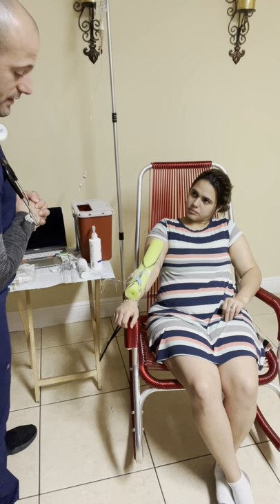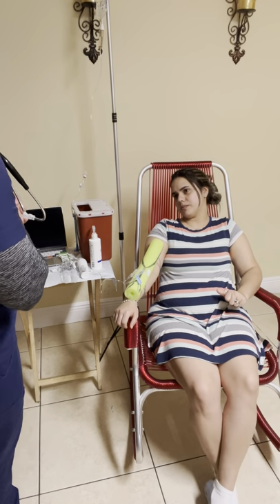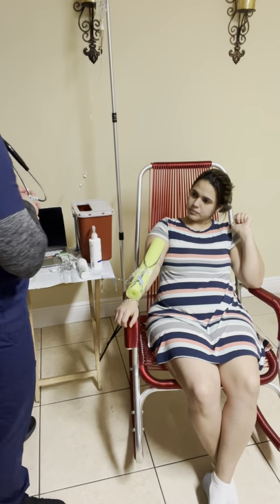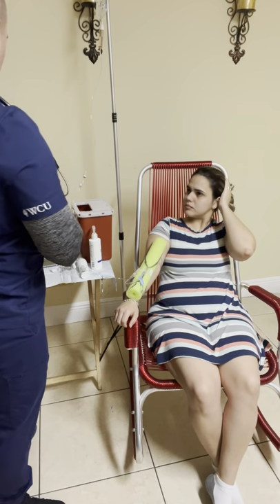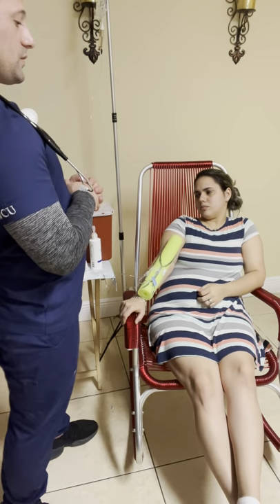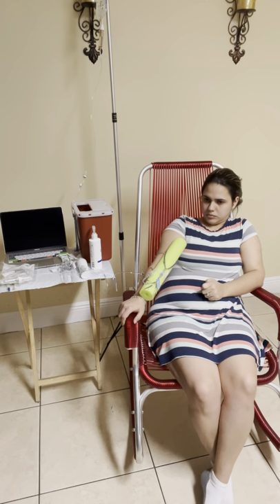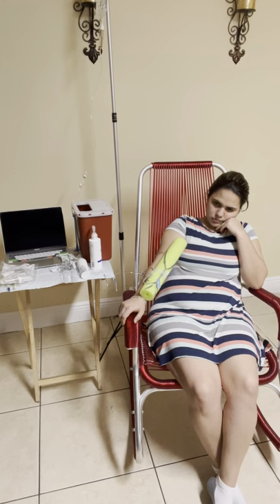Before I give you the medication, I have to ask you some questions, okay? May I have your name and date of birth? Rosalia Benedict, 1 de noviembre de 1991. Okay, perfect. Do you have any medication allergy? No. Any latex allergy? No. I have to ensure the patient's privacy and also safety. Now I'm going to use the glove after hand hygiene.